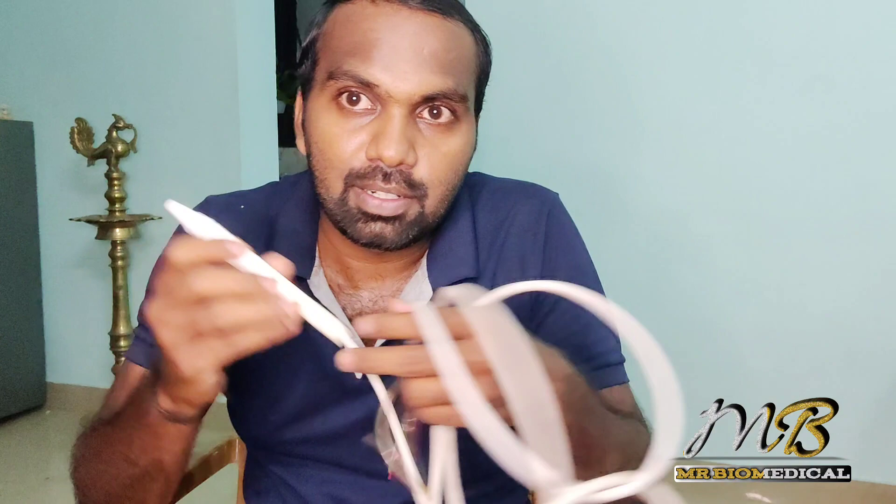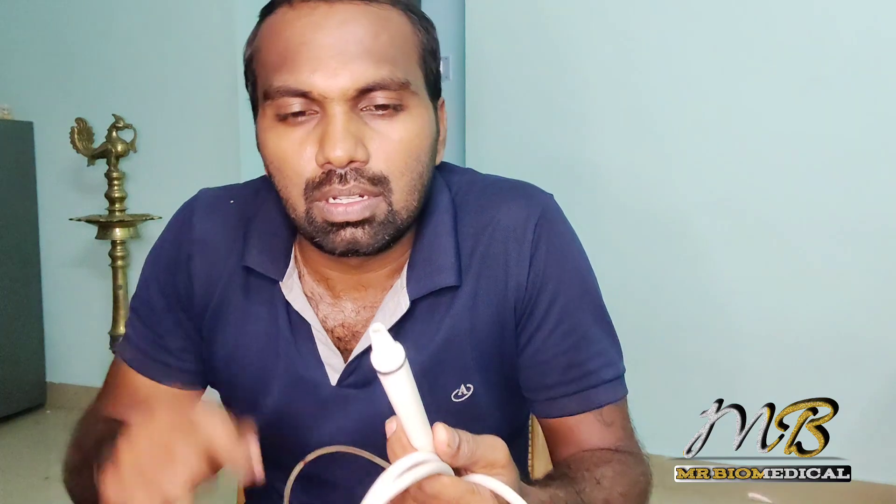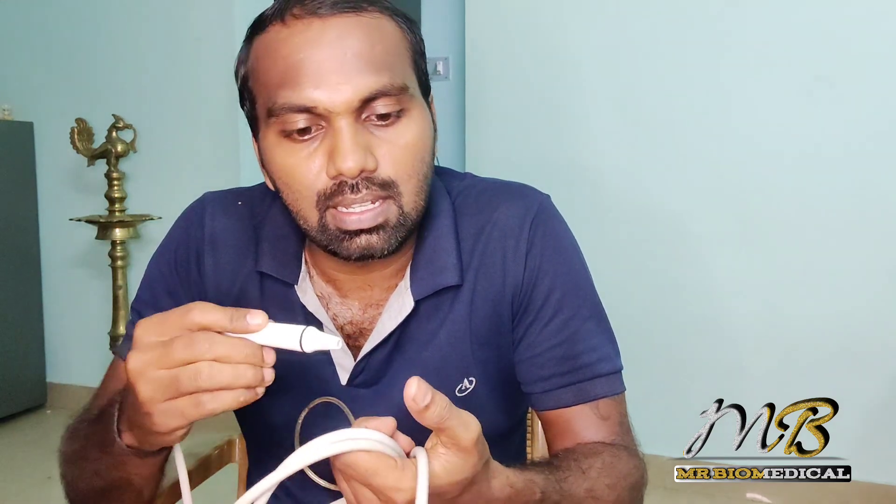Here we have a dental scaler unit which is used to clean the plaque and tartar in patient teeth. It uses ultrasound to create a vibration, and the dental hygienist or dental surgeon will use it for cleaning the outer plaques and tartars. Have you ever wondered what is inside this scaler? Today in this video I am going to tear it down and see what's inside.